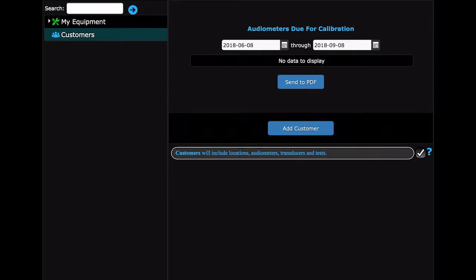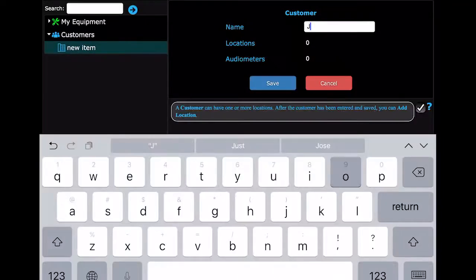First, navigate to Customers in the tree view. Then in the main view, select the Add Customer button. Enter the name of the customer, then select Save.